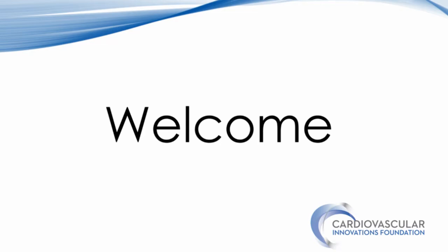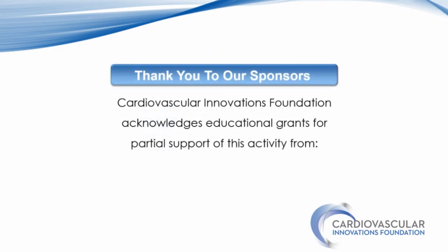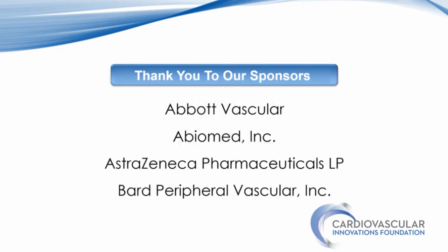Yeah, so it's really on a workstation. So it's software inputting the two streams of live imaging data. And the registration process is software-based, where it's recognizing the orientation of the 3D probe by the fluoro images, and that's a quite simple step to take. I really don't know the commercial cost. I think Philips is the only one with a commercially released system.